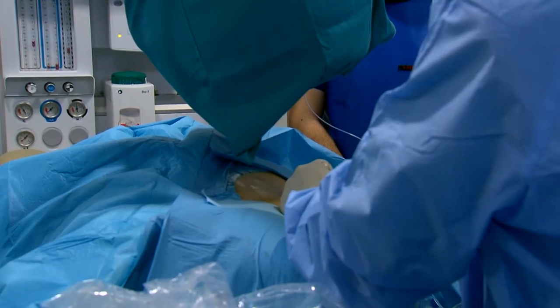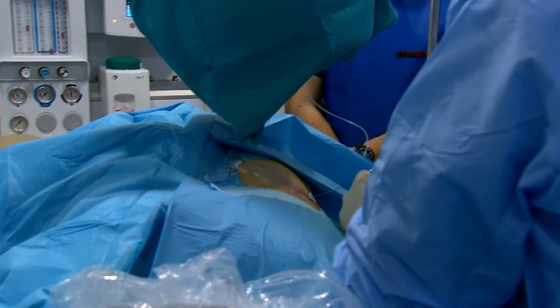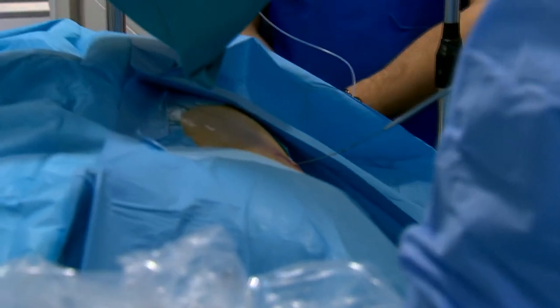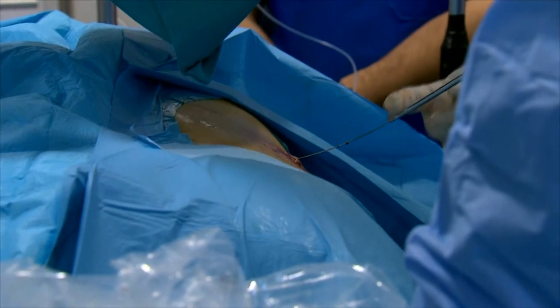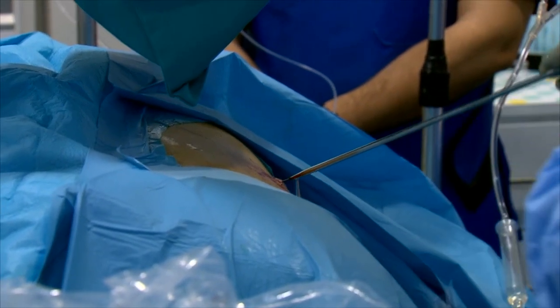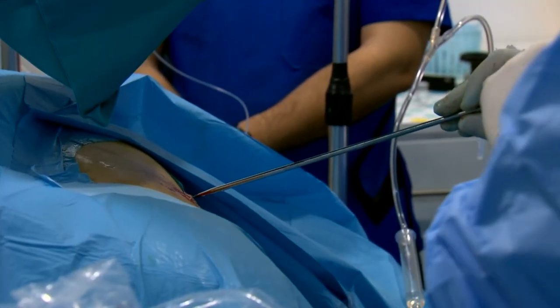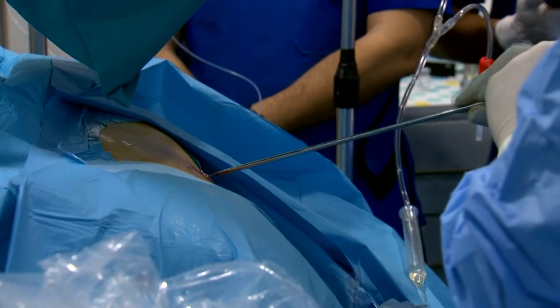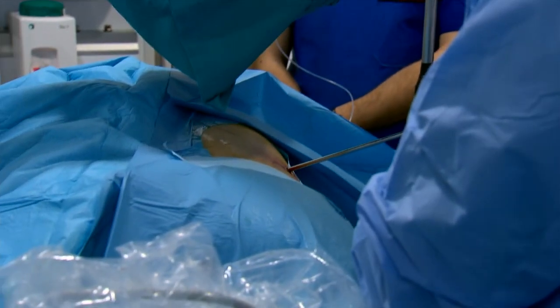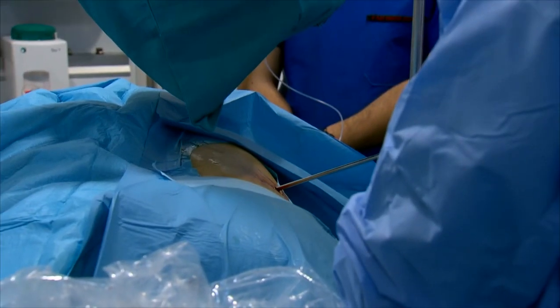What I also prefer is, I always place some gel on the tip of the dilator. And the second tip is, always turn the dilator around. And the dilation is done under fluoroscopic control.